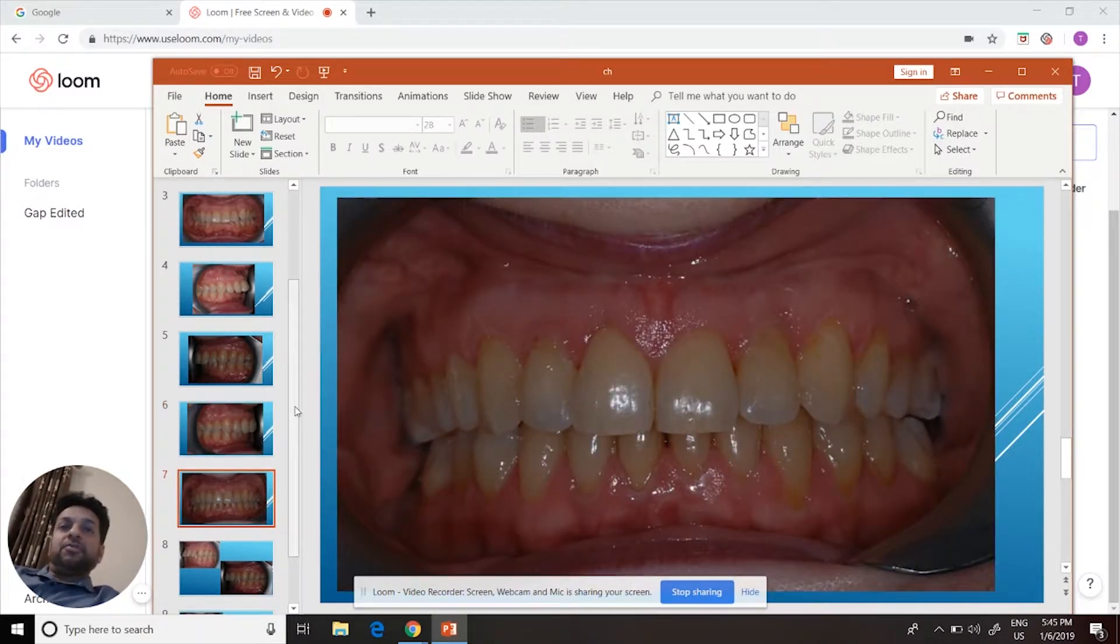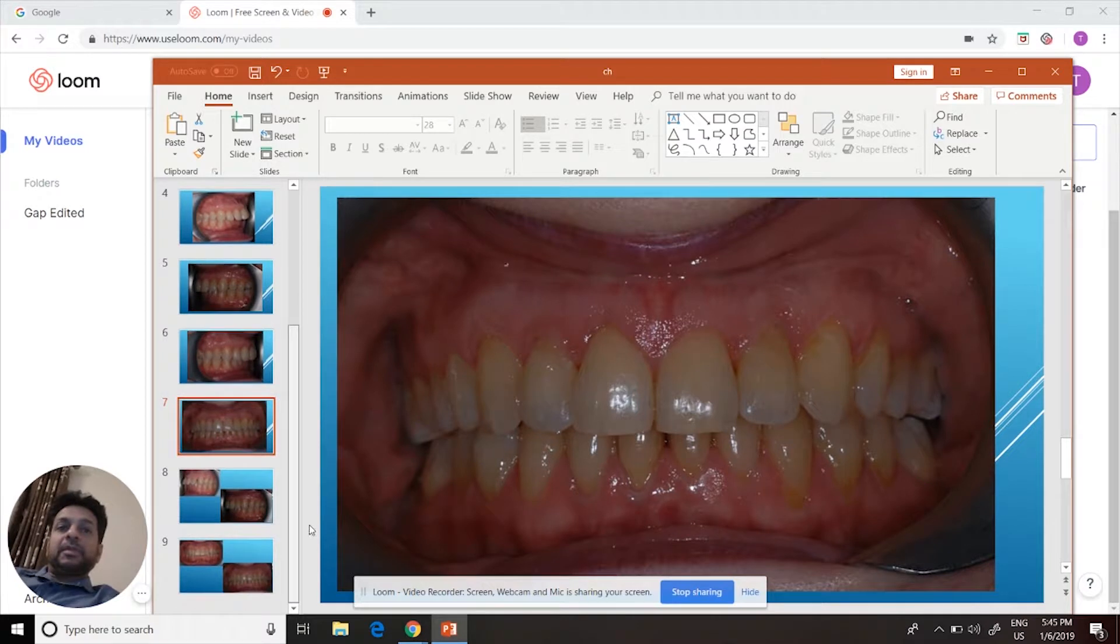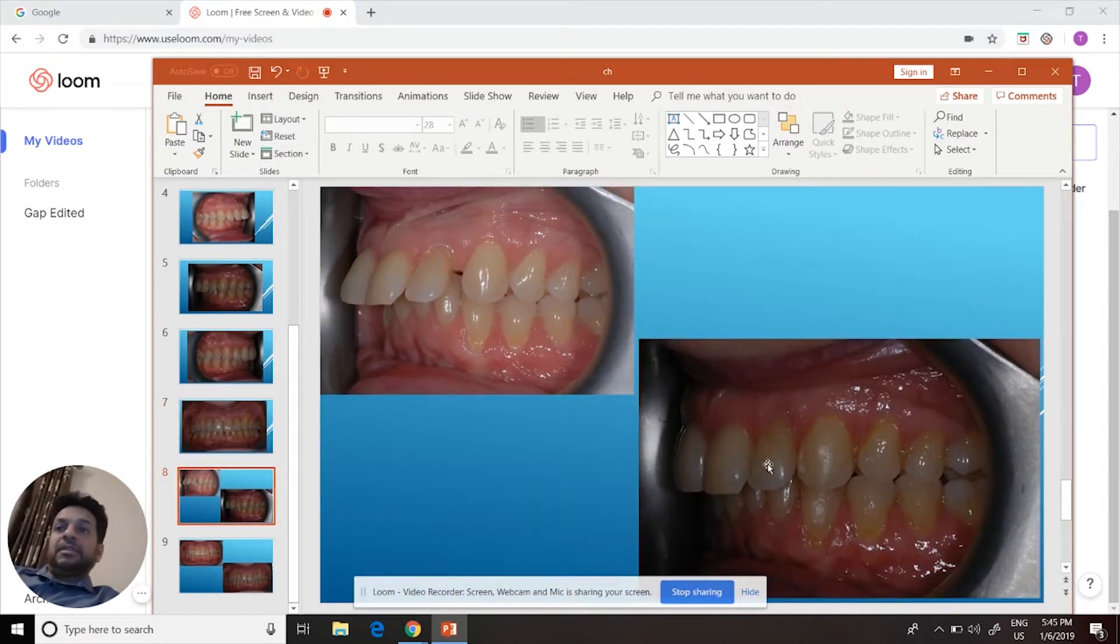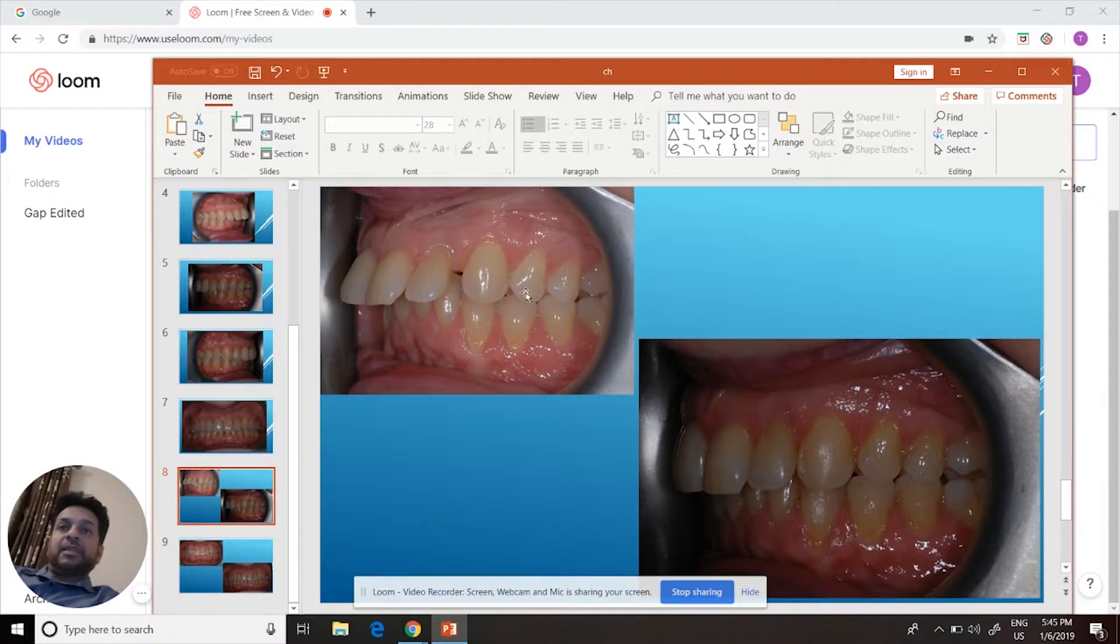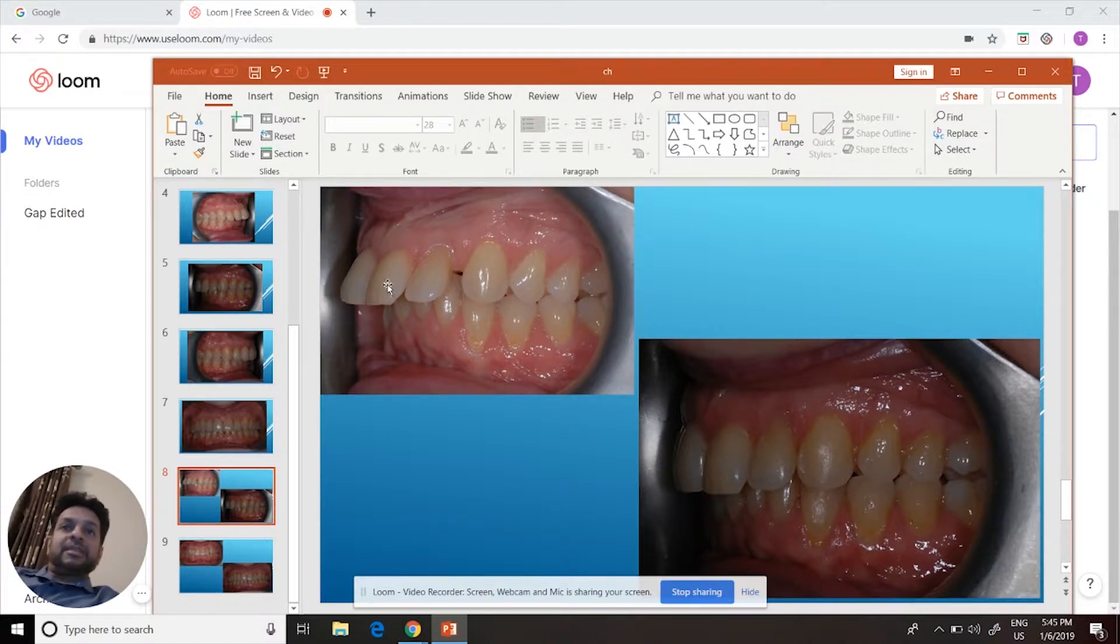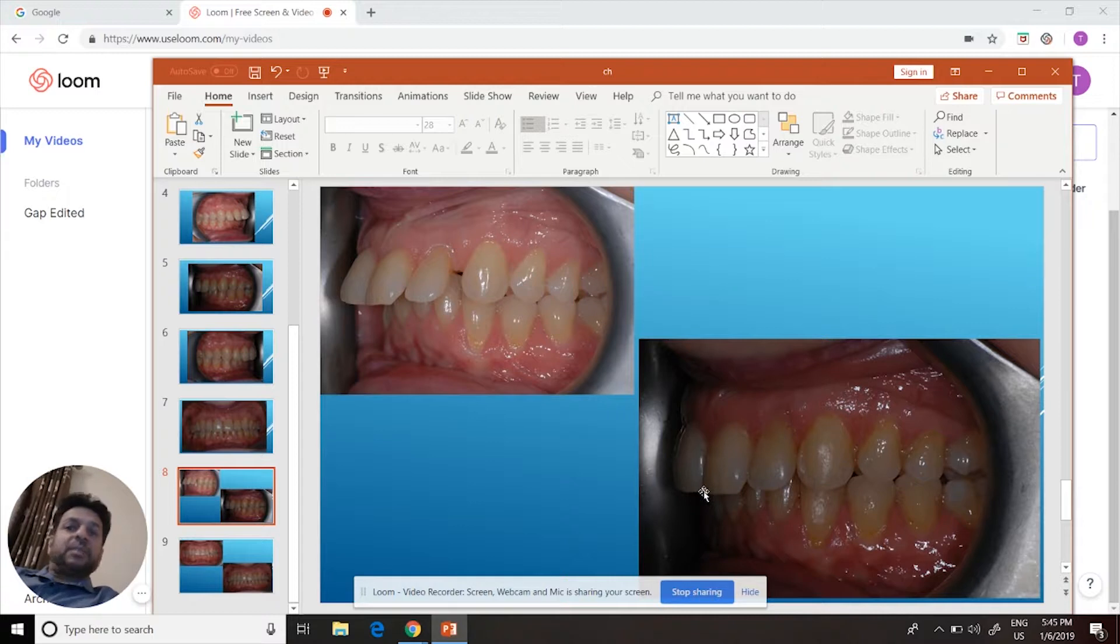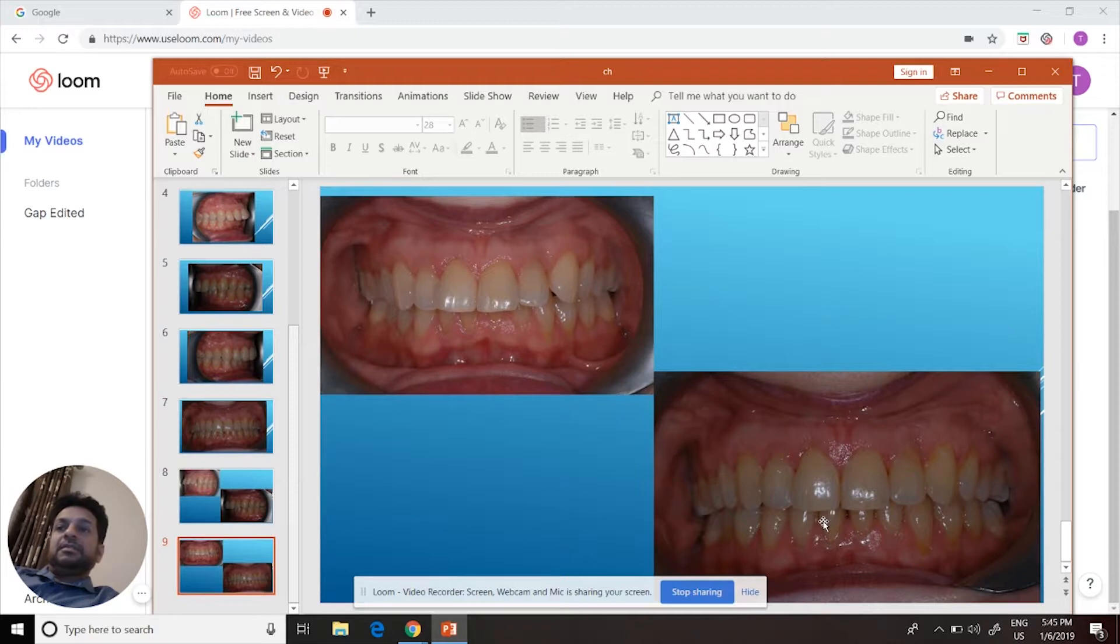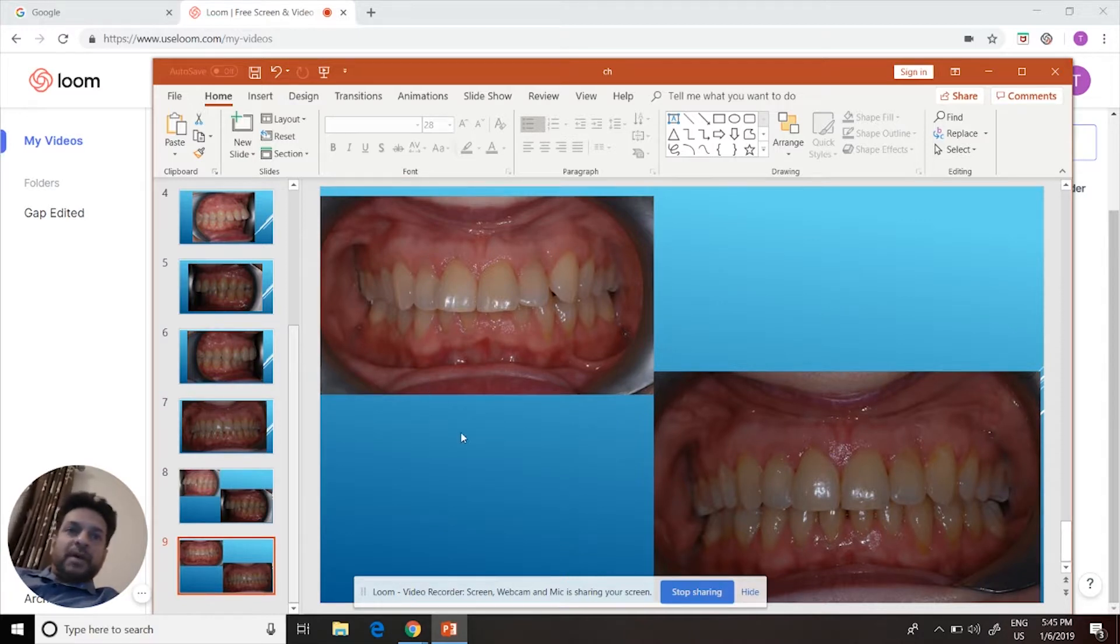Frontal view. Here's the before, here's the after. It took about a year.